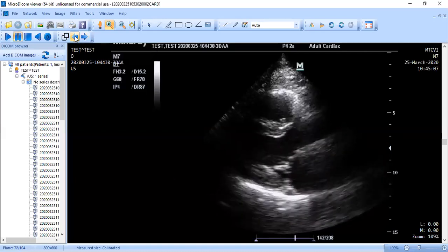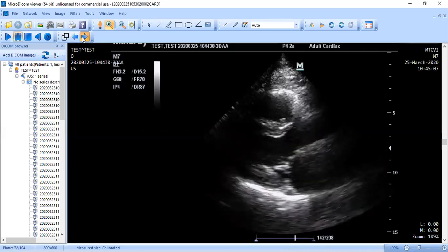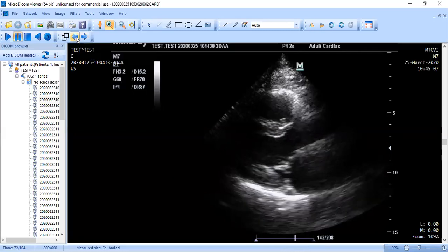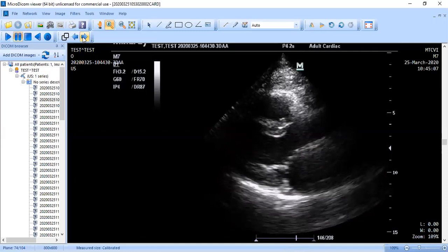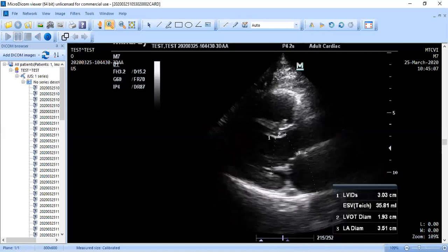So we really just want to come to peak systole where we see that ventricle squeezing at the highest amount of squeeze that we can get out of that ventricle. That's when we want to take those measurements, which is going to be like right there. Okay, so that would be peak systole. That's where we're going to do all of our systolic measurements kind of right in that area. And let's go forward here. Okay, so here's peak systole for us. We've taken that measurement of the ventricle.